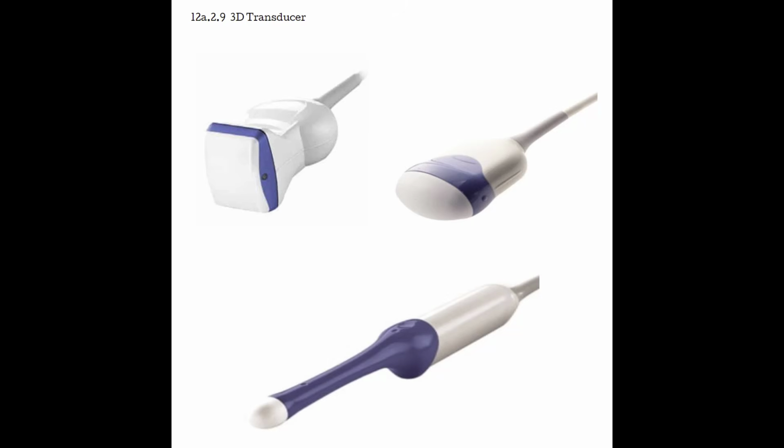Now, a lot of people think that you have to have a special transducer to create 3D images. But in reality, the 3D image is created by the machine. It's the rendering piece of it that the machine does to make sense of all that planar information that it got. So if you have a 1D transducer, but have a machine capable of 3D, you can actually manually sweep through using your normal transducer, and the machine will still do all the 3D calculations.